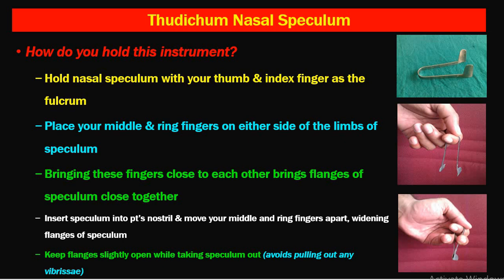The first question is: how do you hold this instrument? The instrument is kept in the instrument tray with the blade directed upwards. Hold it between your thumb and index finger, with the middle and ring fingers on either side of the limbs of the speculum. The middle finger and ring finger are kept on either side of the limb, and the tips or blades are directed towards the patient's nose. Bringing these fingers close to each other brings the flanges or tips of the speculum together.